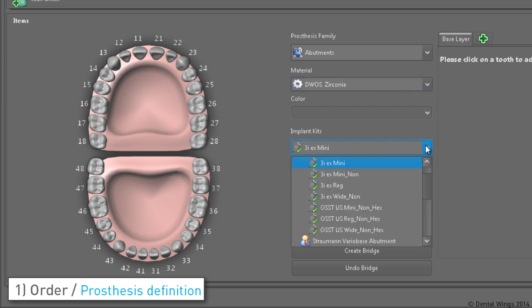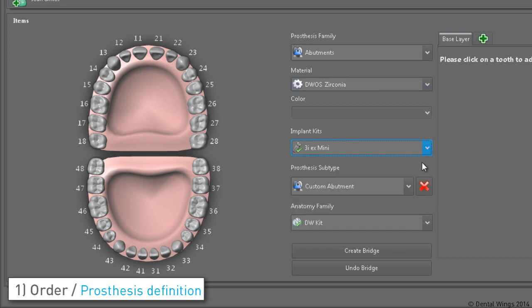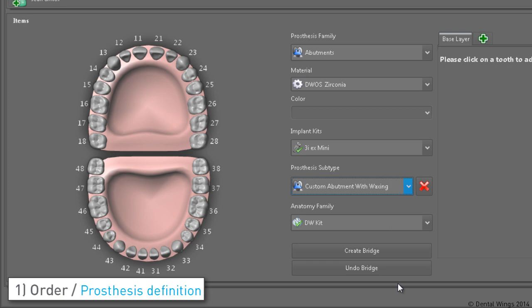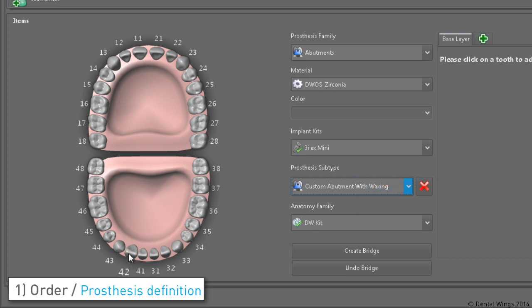Then do the following in this order: choose the implant as per the doctor's orders, select custom abutment with waxing as the prosthesis type, and if known you can select an anatomy kit that will be used to compute the anatomy, or you could just use the default and decide later.